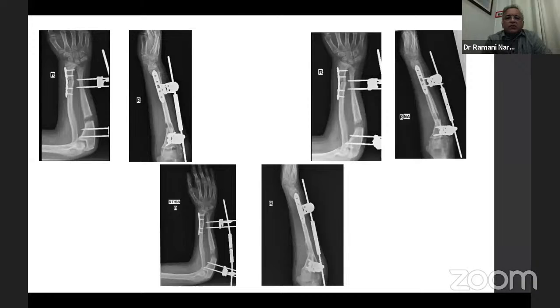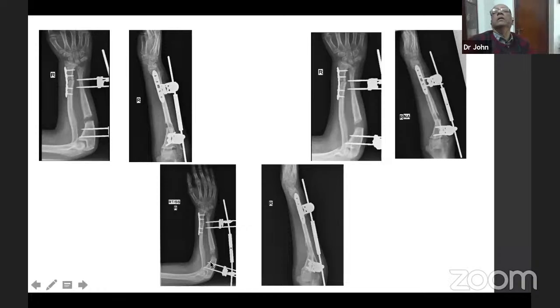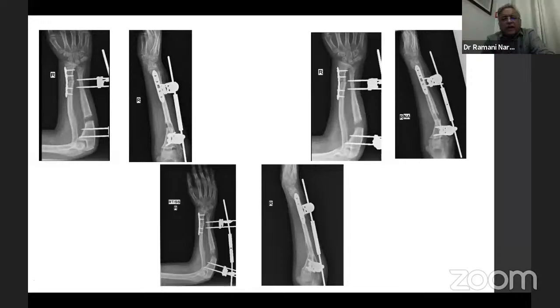But there was this posterior angulation coming in. This particular distractor doesn't hold the posterior angulation. So this was something which I tried to correct, but I could not, to be honest with you. What do you think about this, Ramani? At this stage, yeah, go ahead.